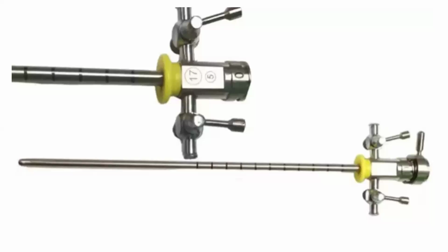All the uses start from the urethra and go inside. Tell us, can you bypass the stricture with a ureteric catheter? Yes, sir. If there is a bladder neck obstruction, that also you can use it for. As you said very rightly, clot evacuation, foreign body. You can do cystolithotripsy. You can use laser to break the stone.